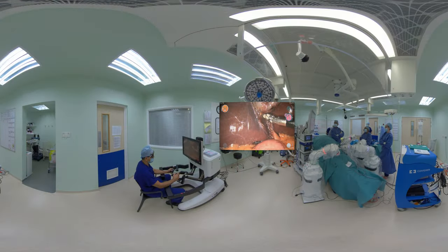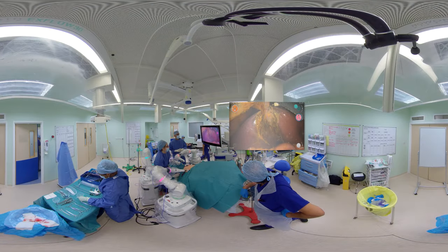The cholecystectomy is completed by separating the gallbladder from the liver using diathermy.